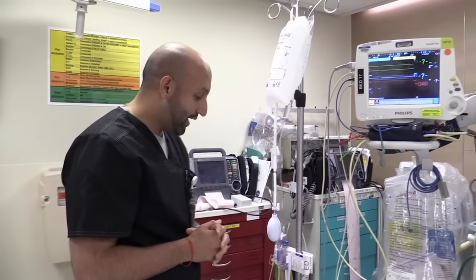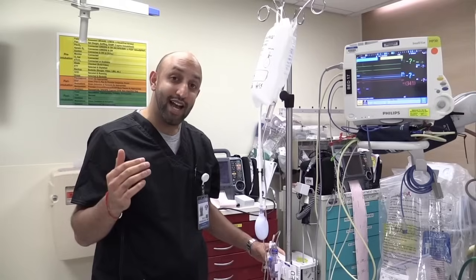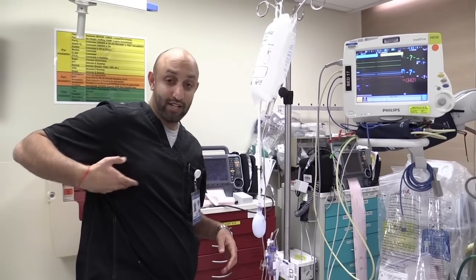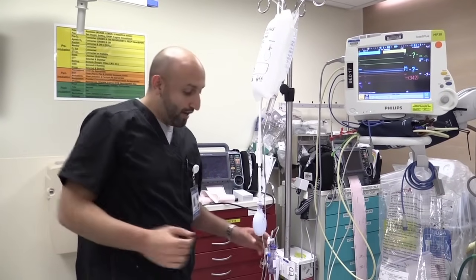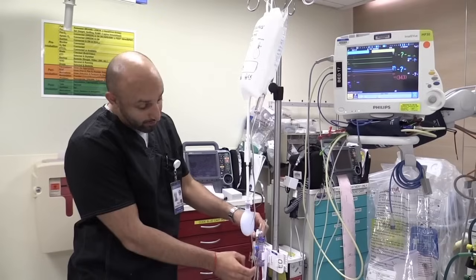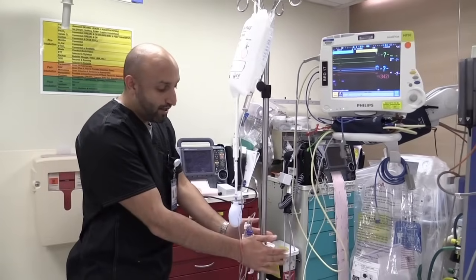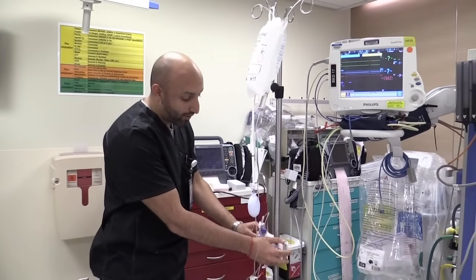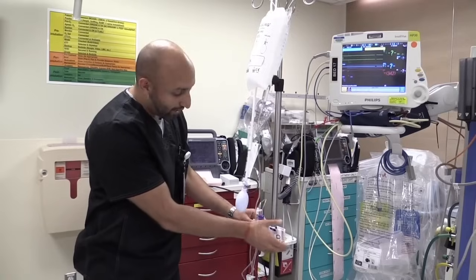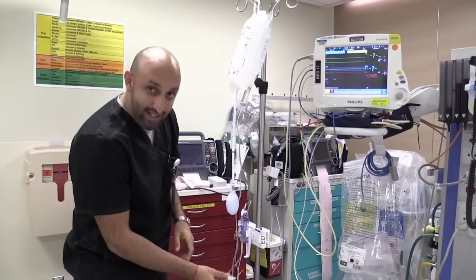One more thing I forgot to mention: when you actually set this up, you always want to make sure you set it up at the level of the patient's phlebostatic axis, which is the intersection of the nipple and the fourth intercostal space — essentially the fourth intercostal space and the mid-axillary line. That's where you want to set this up on the patient's body. Some people would tape the transducer to the patient's side with older systems, but if you have this system it's much easier to keep it attached to the stand. Make sure that height is correct. If you have a dampened wave, check your bag, make sure the height is okay, make sure all the air bubbles are out, and make sure there's no kinks in the tubing.